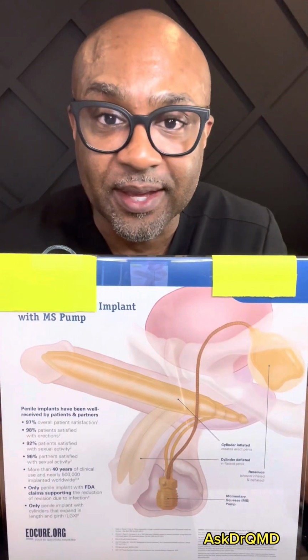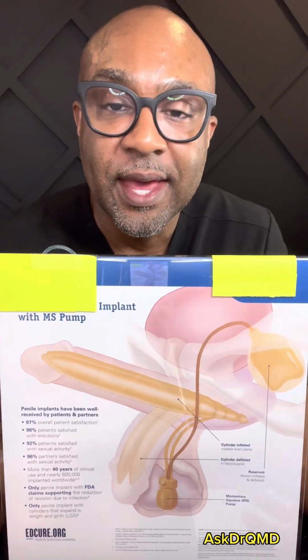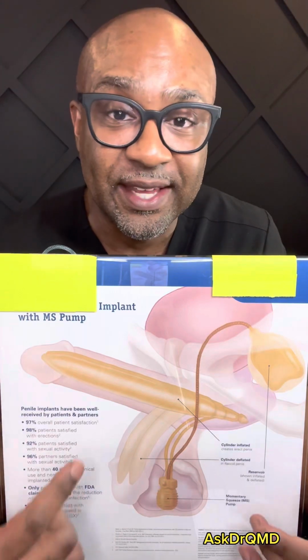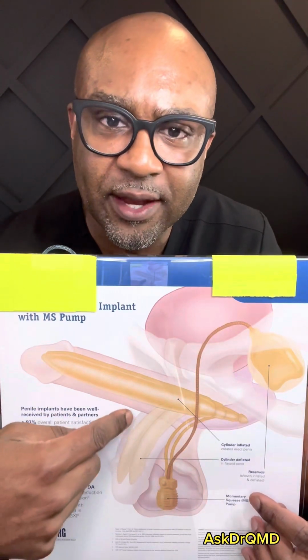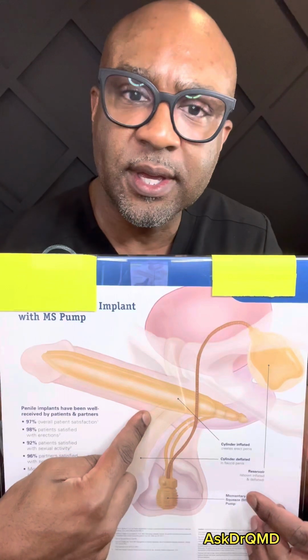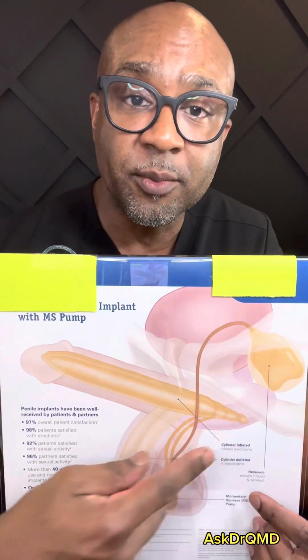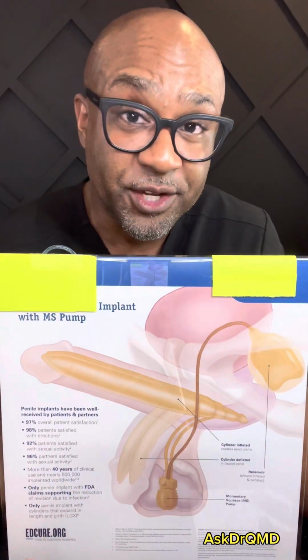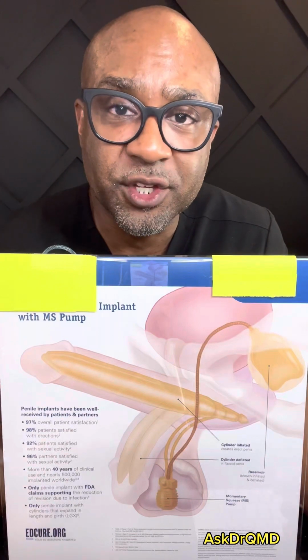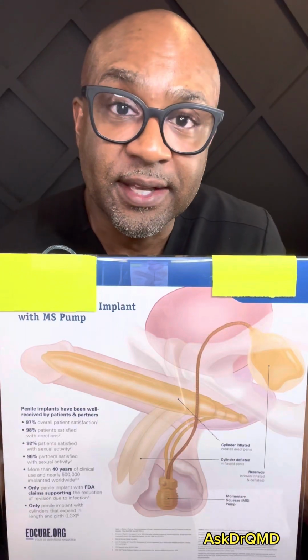Now, a lot of guys ask me, what size are you going to put in me? And the answer is, I don't know. We actually have to measure you. A lot of people don't know this, but the penis is a lot longer than you think. In fact, a lot of it is hidden. So if you look around here, this is about the point at which you can see the exposed penis, this length here. But if you look back here, you see the penis actually extends all the way back to the pubic bone. And so when we're sizing out a prosthesis, we have to measure the entire length to get our size for the prosthetic. So we try to fit you with exactly what you need in your stretched length in order to maximize your size.